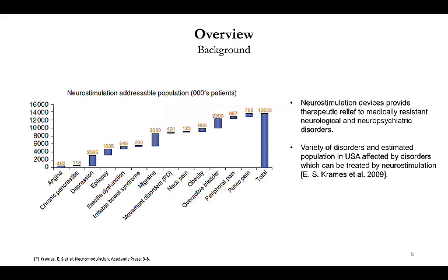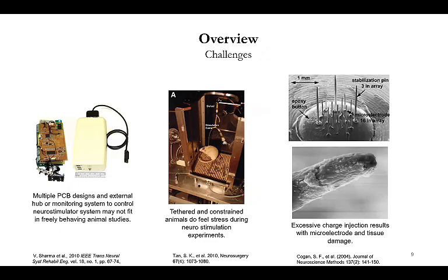These are the common applications of neurostimulation. These applications are getting broader through time, and because it is really effective, this whole neurostimulation idea is called bioelectronic medicine, and now this field is very popular in cases where drugs don't work for certain diseases.